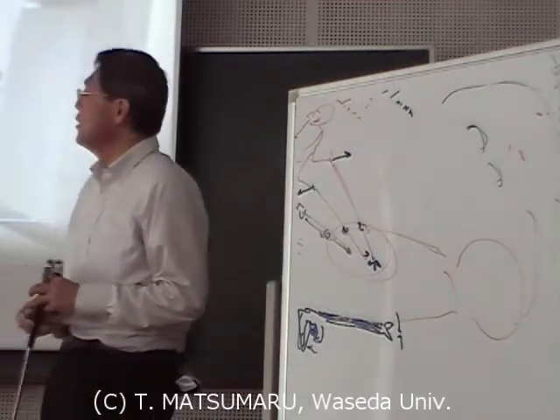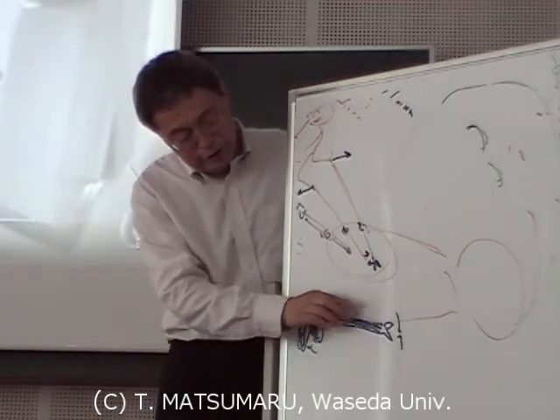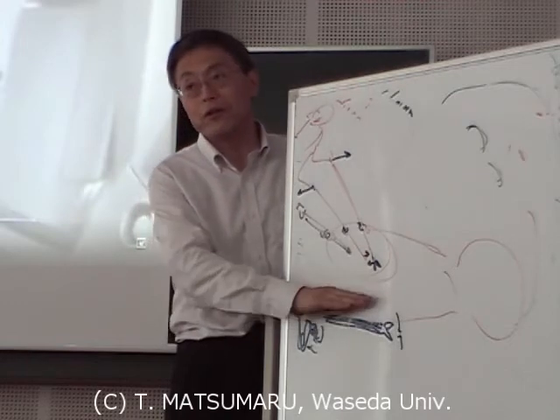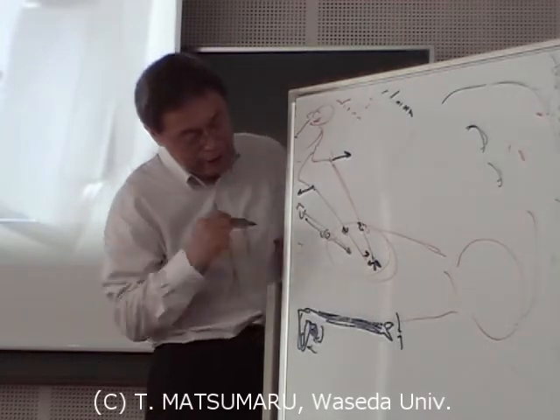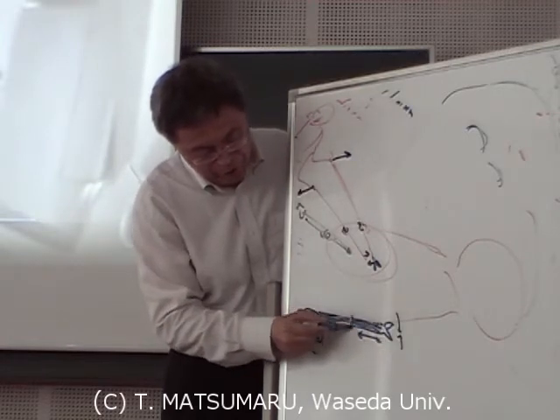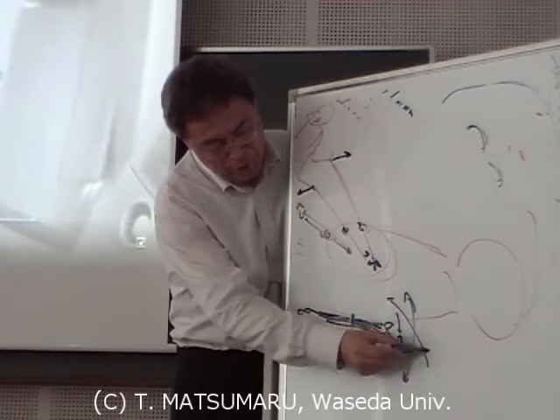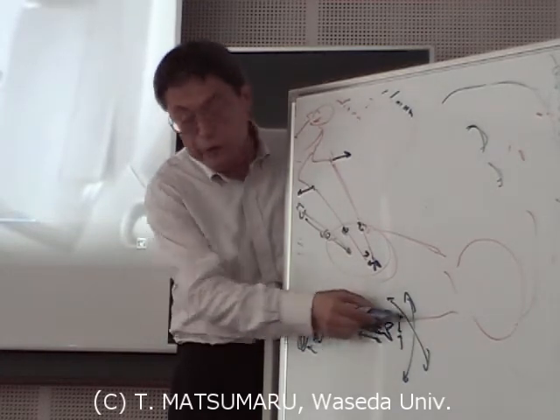But this robot has 6 degrees of freedom of movement. It can rotate, of course, and move in this direction, this direction, and also make pivot movements. Of course, movement and release.